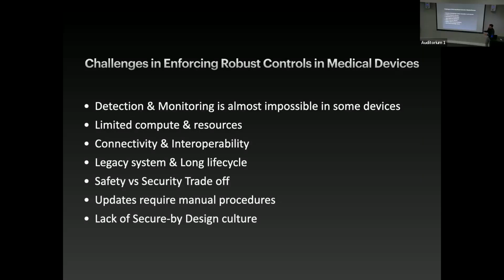And lack of secure-by-design culture. Security should not be built on top of the devices. Instead, it should be built alongside the product development. Some engineering teams, I have seen, don't have a proper secure-by-design culture. Instead, security is just a checkbox to them. And that's exactly what should change.